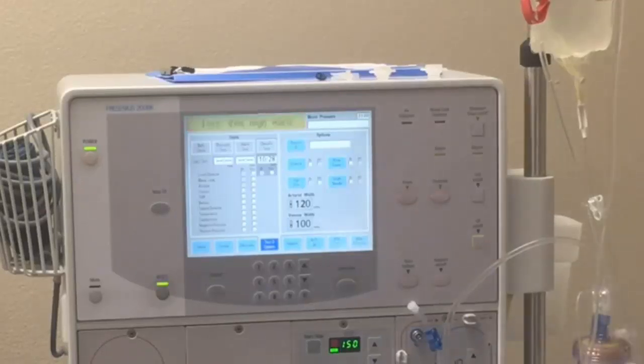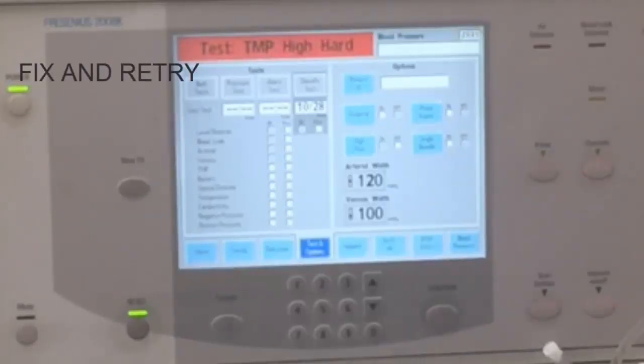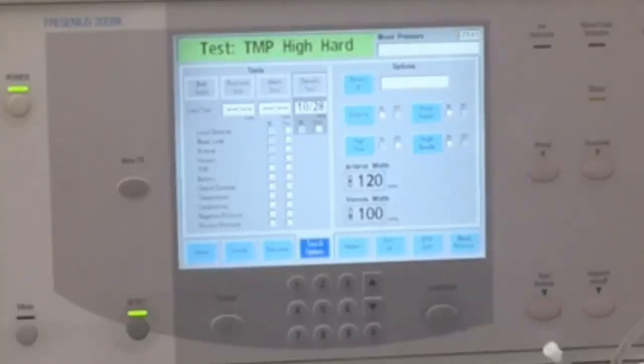So during this test, all it's doing is going over pressures and different areas that we use to monitor our patients. If any of these tests don't pass, we cannot use this machine. What we would do is retry the test — first we'll see if there's something we can fix, then we will retry the test. And if the machine is not passing tests again, we will have to pull out this machine from the dialysis unit and bring a new machine.